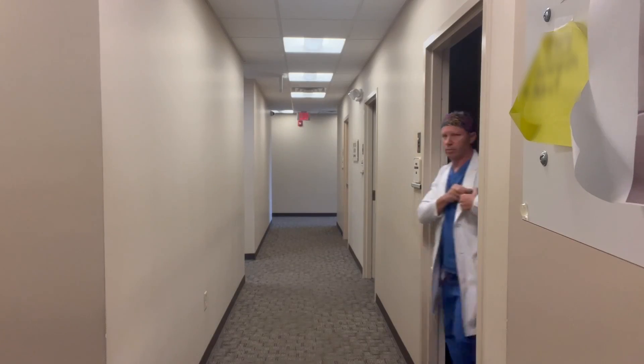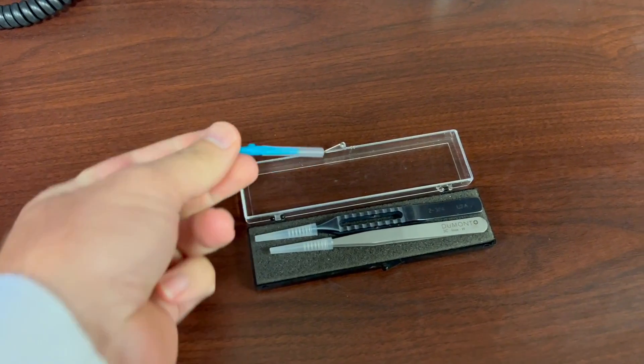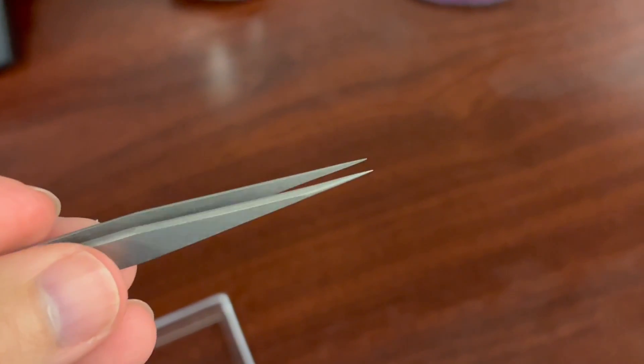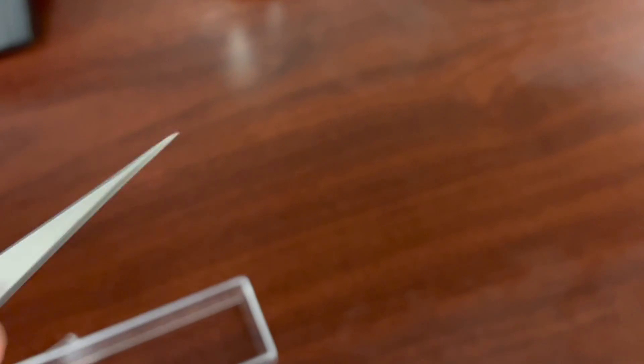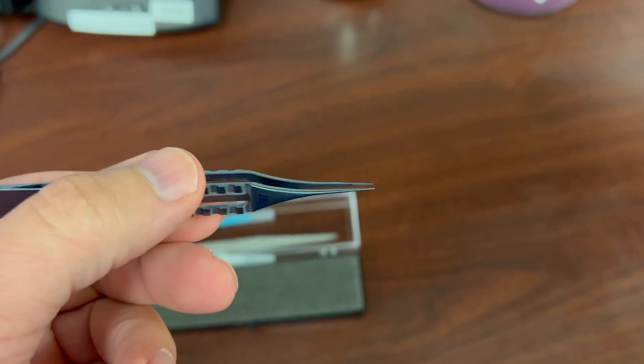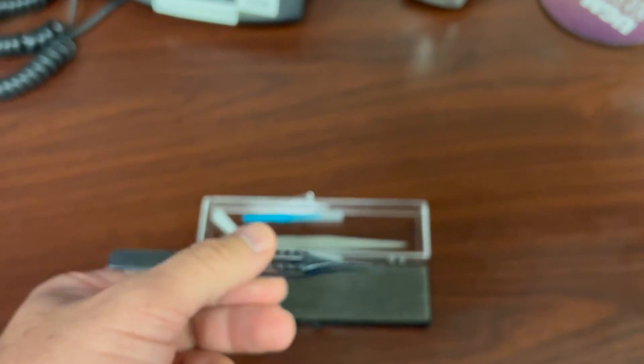There are two things that I carry around with me all day in the office. One is a sharp blade, and I can use that sharp blade to cut stitches in the cornea. The second thing is a jeweler's forcep. I also have a tying forcep — I think it's because I'm afraid if I drop my jeweler's forcep, I've got a backup just in case.